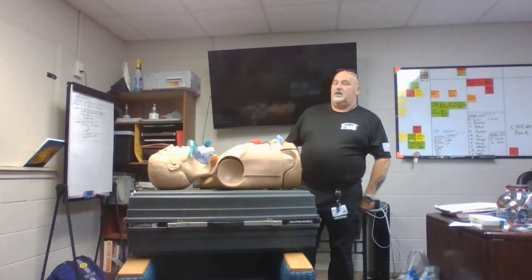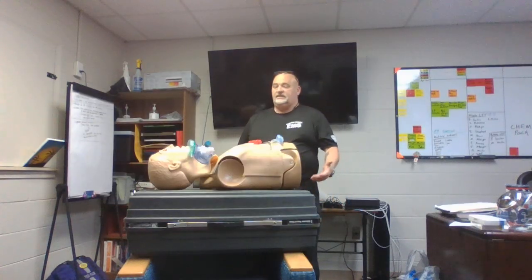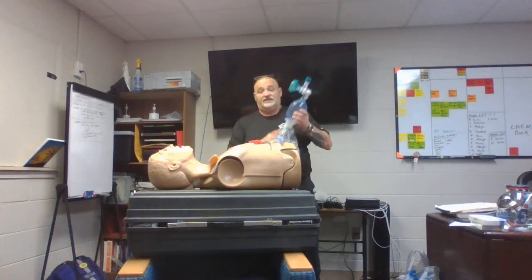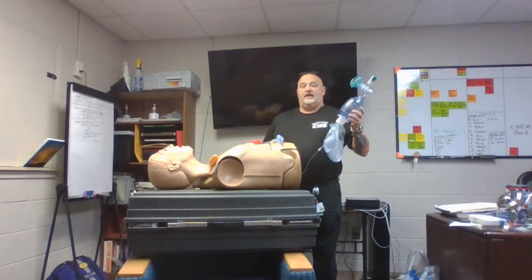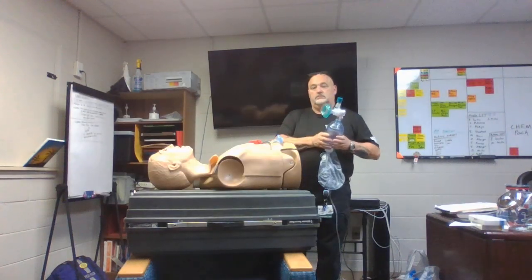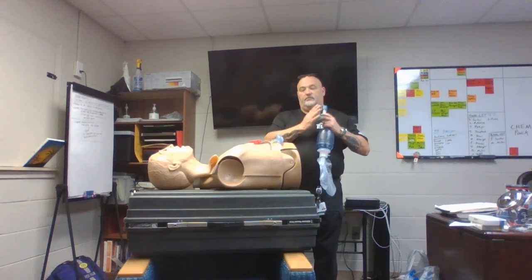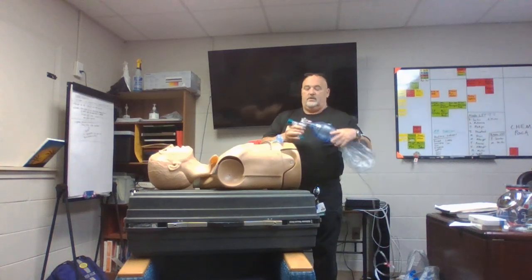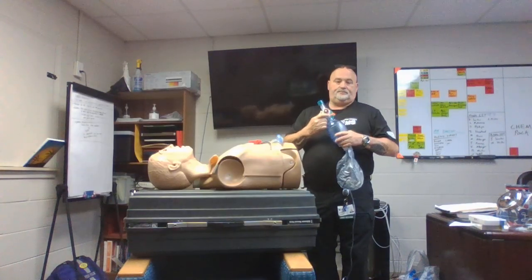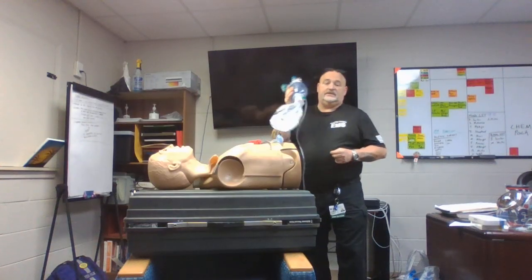I'm sorry if I talk with my hands, it's just what I do. I apologize. So with that being said, we're going to talk about bag valve mask, which is the basic of the basics, right? Everybody claims that they know how to use a bag valve mask. Do we? Do we know how to properly use it? First of all, we have to have the right size mask on it. What is the volume? They make some that have little flashing lights on them that blink every 6 seconds. Why? It's a reminder to squeeze that bag.